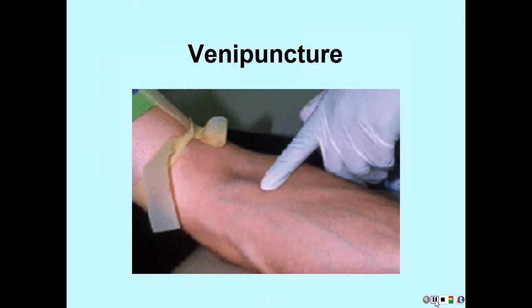But when we're talking about venipuncture and blood drawing, we're going for the antecubitals. You know, the other ones I said try to stay away from those. But in venipuncture, we do want to start looking at the antecubital veins there.